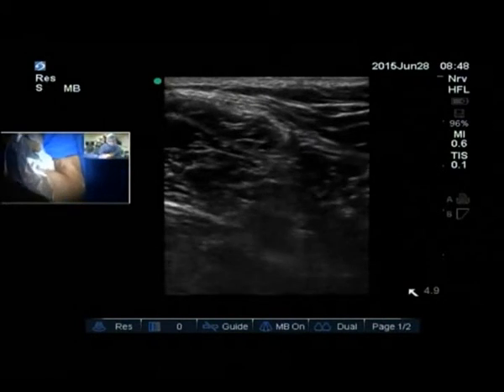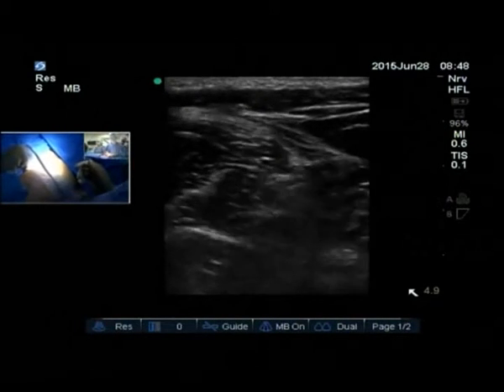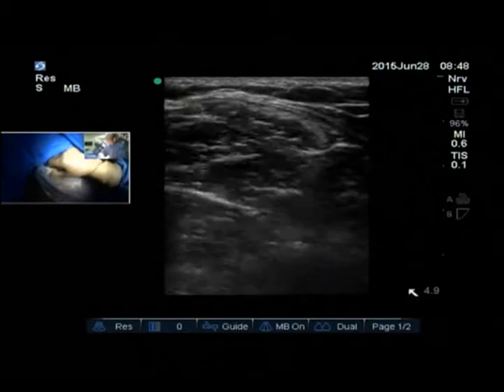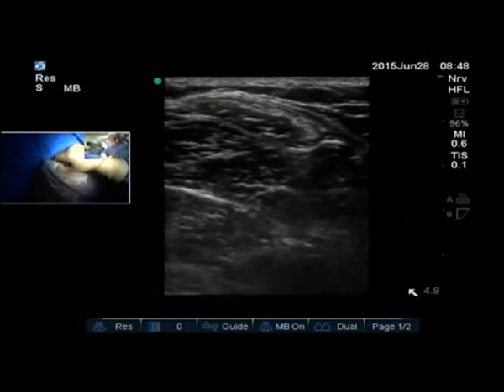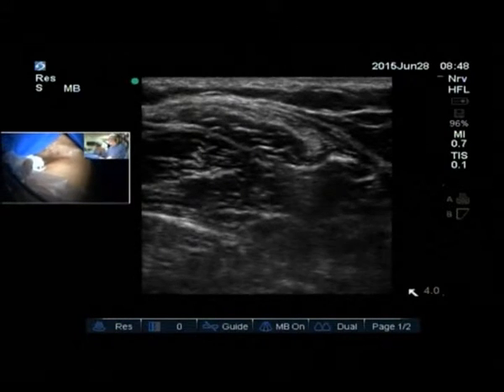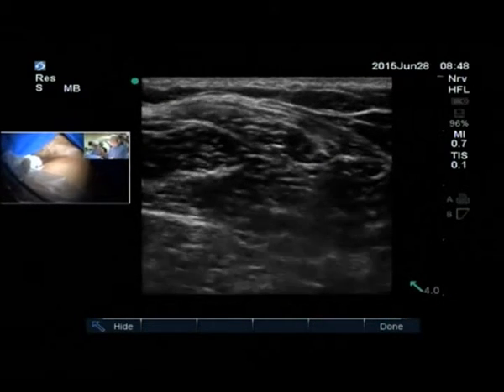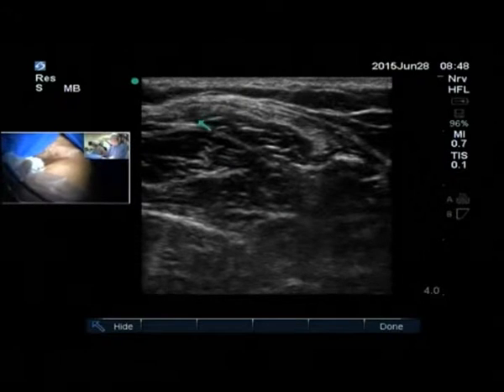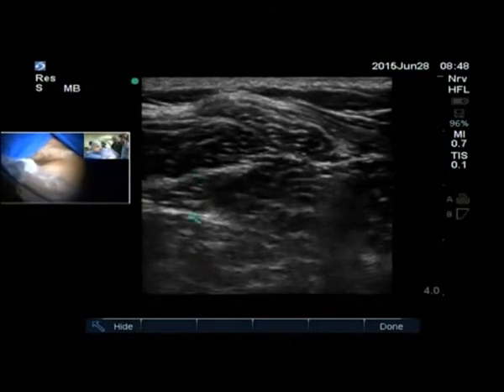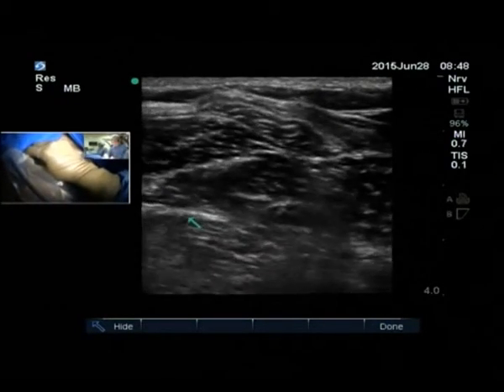Okay, so right now, can we move this one out a little bit? Just a little bit more. So here, you see the fascial planes. We can maybe decrease the depth a little bit. Okay, so you see 2 lines, one very deep and very bright on the medial side where the dot is. It's about 3 centimeters deep. This one would be between the adductor magnus that is deep and the brevis.